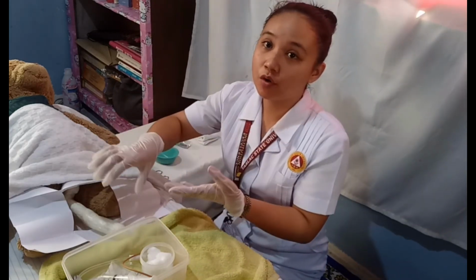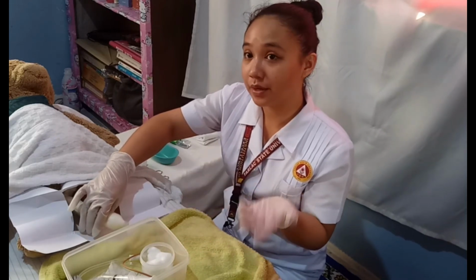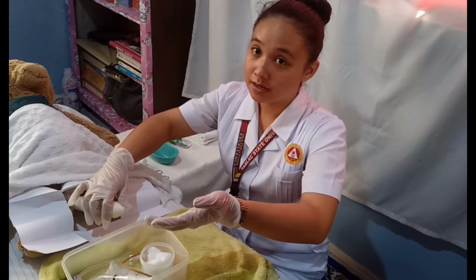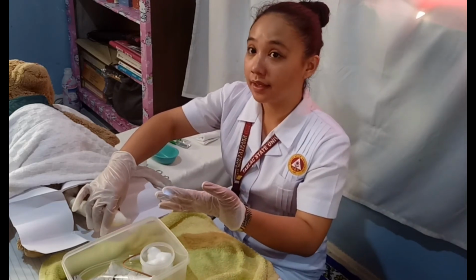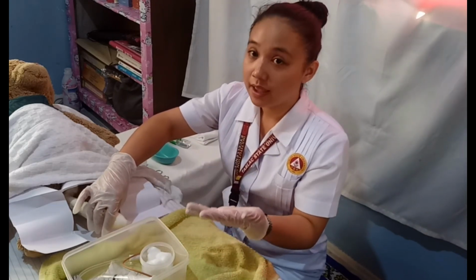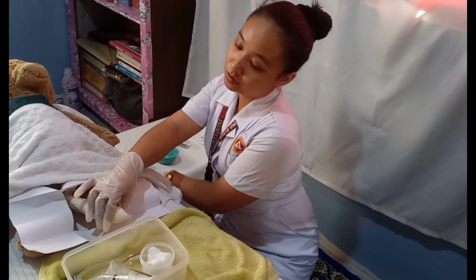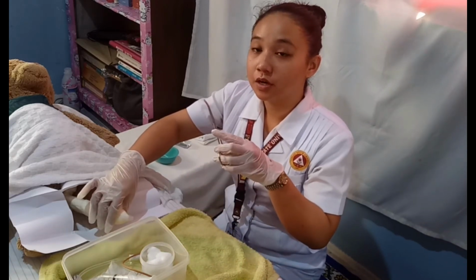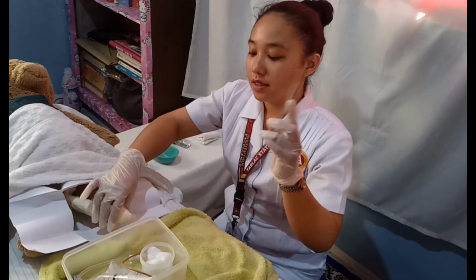Now, after putting on your gloves, you need to lift the penis with your non-dominant hand, which is then considered contaminated, and you need to retract the foreskin in the uncircumcised male patient. Clean the area at the meatus with a cotton ball held with forceps, using a circular motion moving from the meatus toward the base of the penis, 3 times.